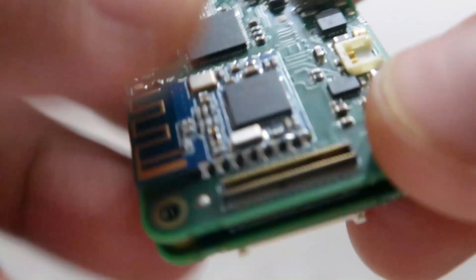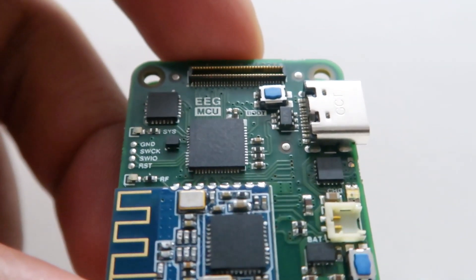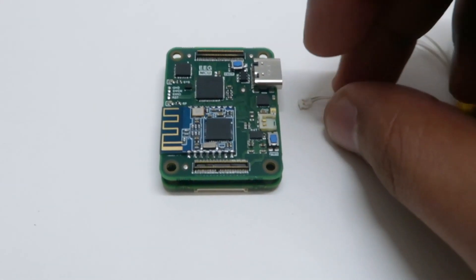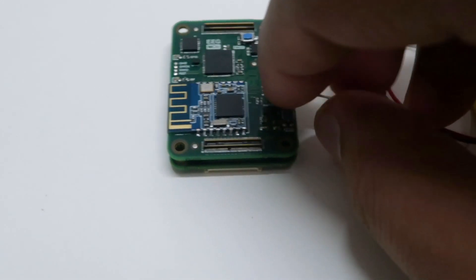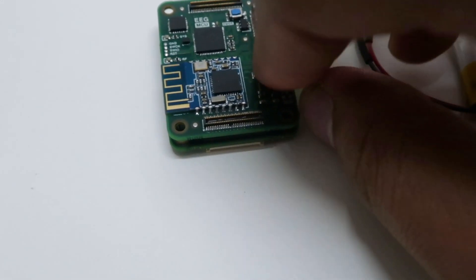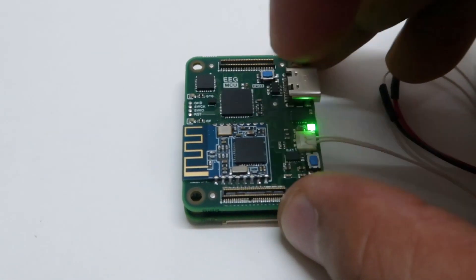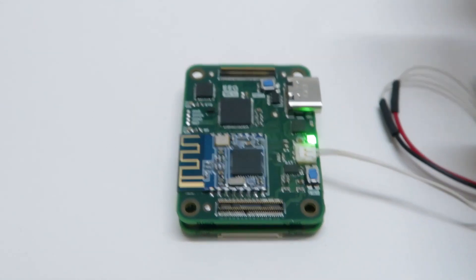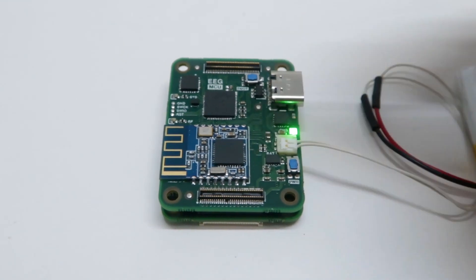Before powering it on, I'm going to connect the JST connector of the battery to the board. This LED is the power LED and also the charging LED — when you plug in the USB-C for charging, this green LED will turn amber.